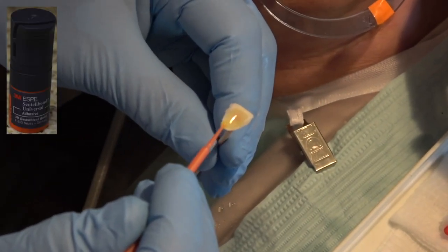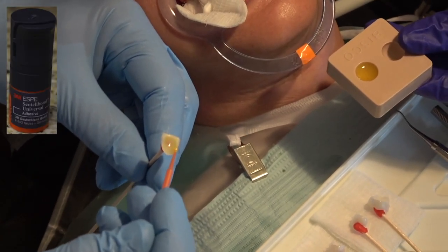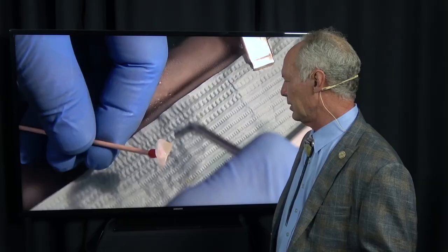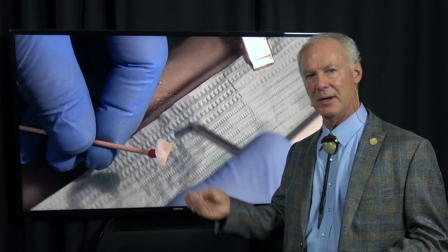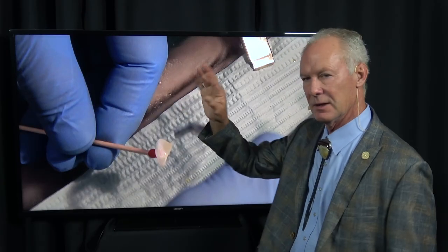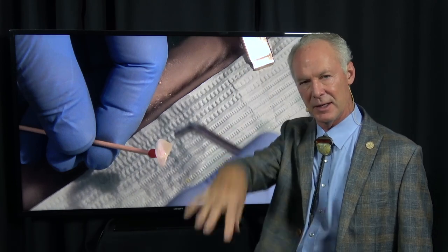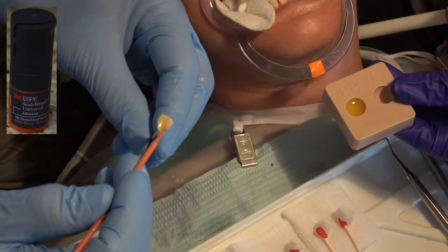Then we're going to place primer adhesive on the two sides of the veneers and blow it off - that's very important. The reason you blow it off: there's an acetone carrier in the primer adhesive that carries the primer into the dentinal tubules, and it's attracted to moisture. Even though all the preps are normally in enamel, I still don't desiccate the teeth - I just blot them dry with a two-by-two because a little moisture helps pull the primer into the enamel areas.